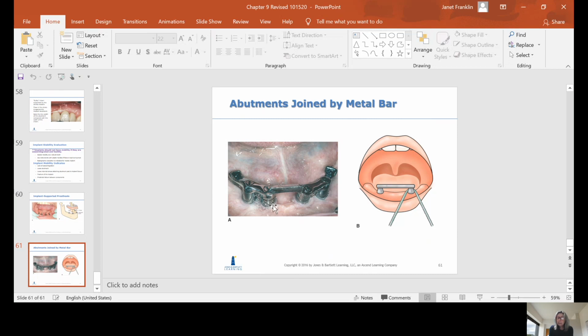But the patient needs to be able to get to these implants and clean them. So usually the patient can pop that denture off, and they can take their cleaning devices and clean their implants really thoroughly. They can use an electric toothbrush, and then they can go around like in this picture with some floss and clean around the implants, flush it with a water pick or whatever it is you gave them to keep these clean. And then they're going to clean the prosthetic device as well. So they'll brush the removable denture, and then they'll go ahead and pop it back on.